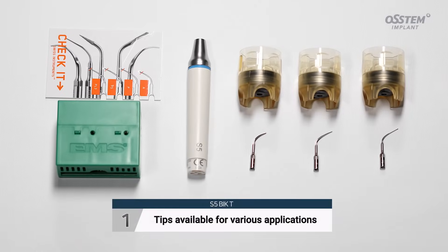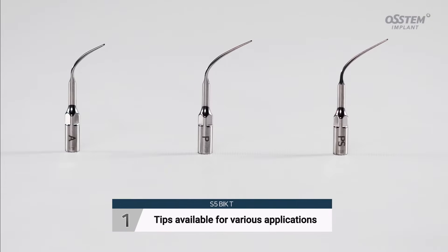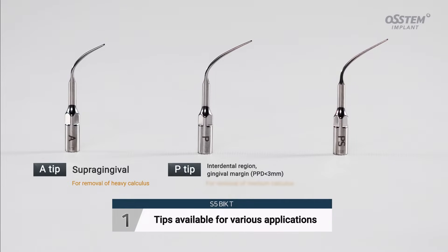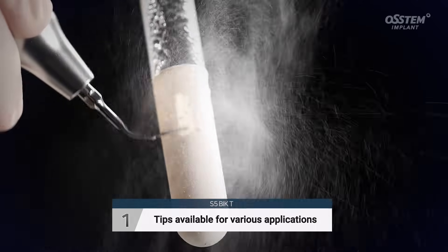The S5T scalar can be attached to the dental unit chair. Three tips are included: the A-tip, P-tip, and PS-tip, allowing you to choose the appropriate tip depending on the patient's oral environment.